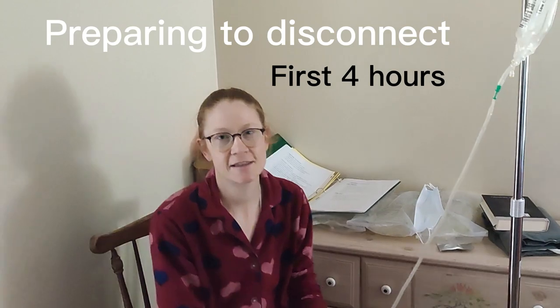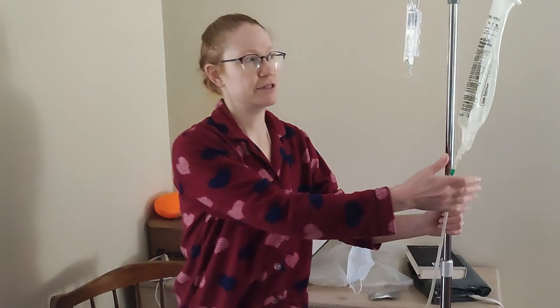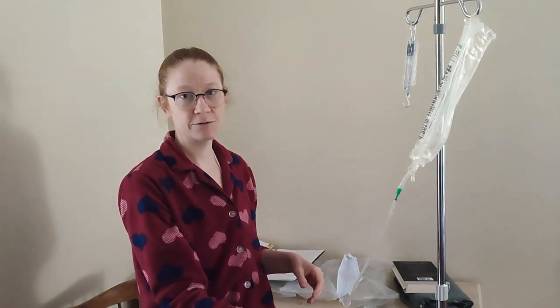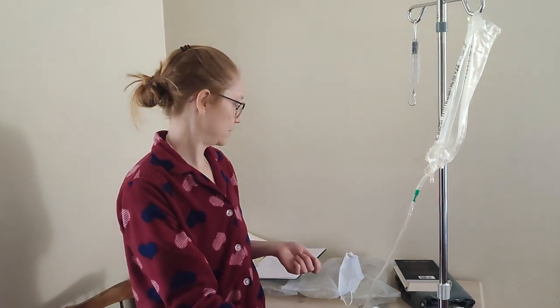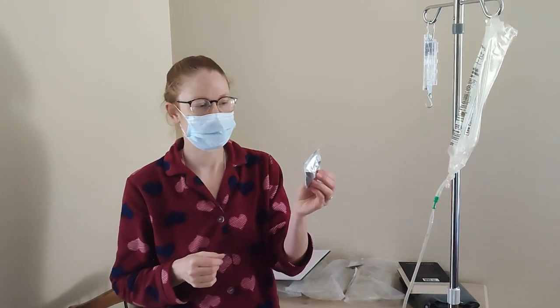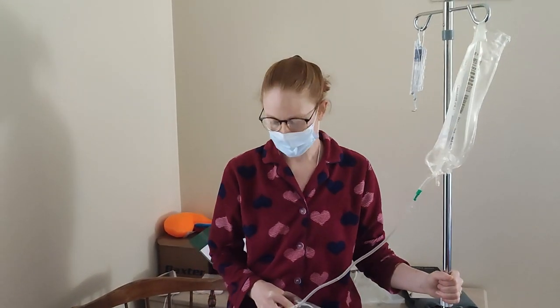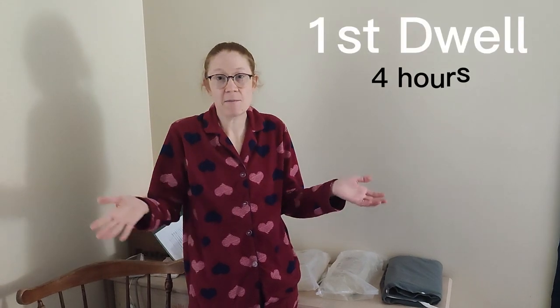I'm all done filling. I like to put both of the red clamps on just so I'm in the habit of that. You also want to make sure your twist clamp is closed on your catheter. I used a yellow bag this morning and it's going to dwell inside my peritoneal cavity for about four hours. Now I'm ready to do my two-minute hand wash and disconnect myself. I'm going to get my mask on and get a cap for my catheter ready — you want that opened and set out before your two-minute hand wash so everything is ready to disconnect. Now that I'm disconnected, I'm free to go about my day. The fluid is just going to sit inside me for about four hours.